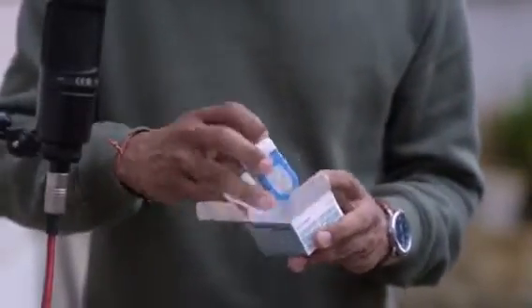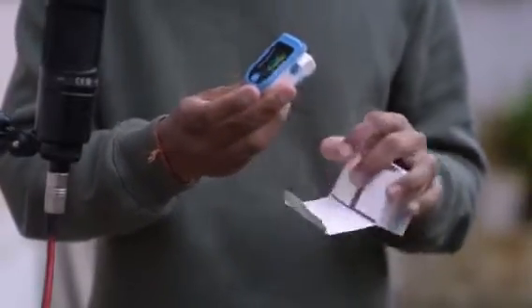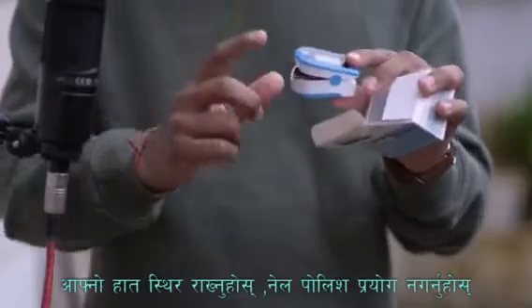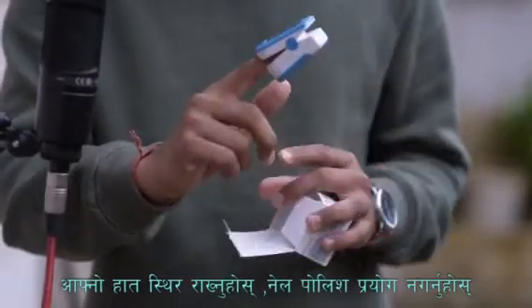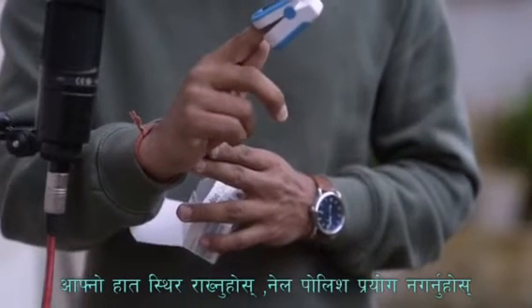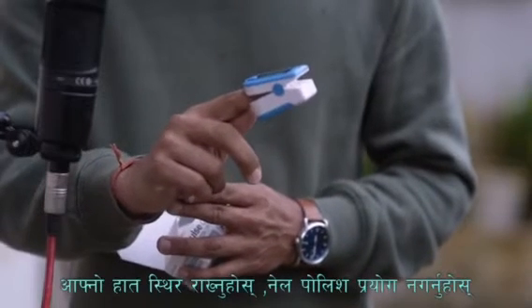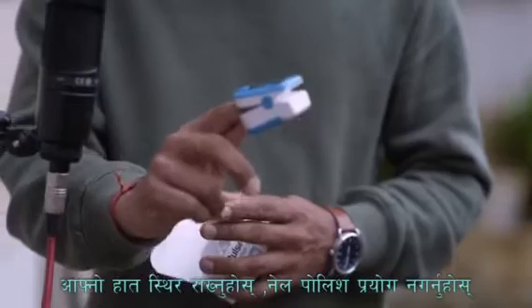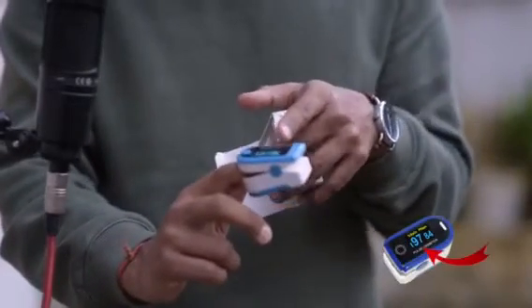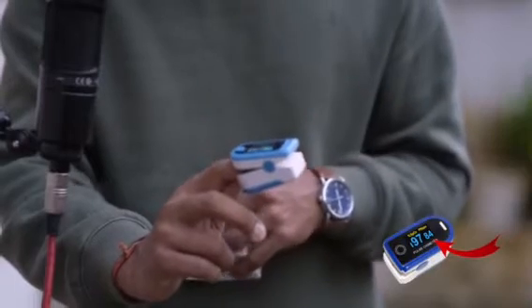I have already inserted the battery. Open the device and place it on your finger. Keep it on for almost 30 seconds at least, and then you can read it. Here you can find the reading — 97 to 99 is my oxygen level, and 81 is my heart rate.